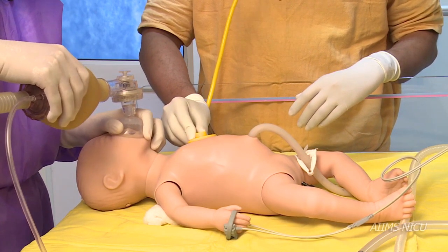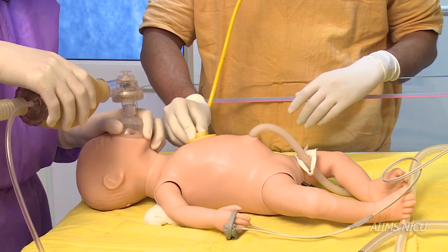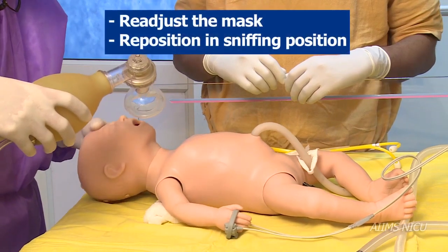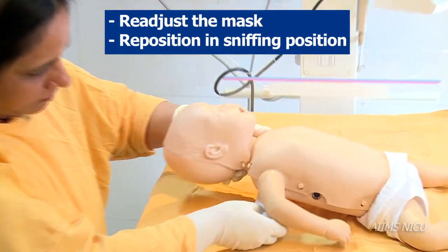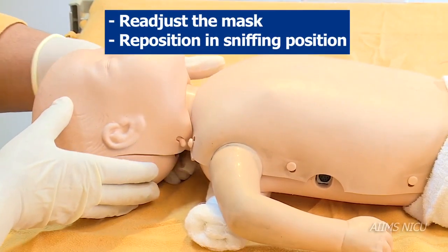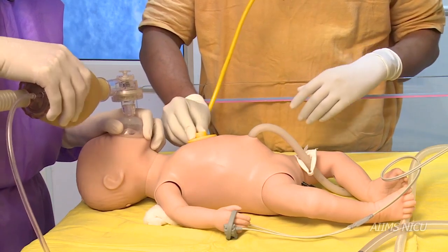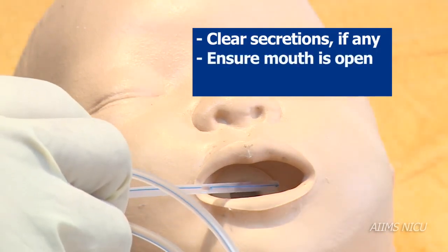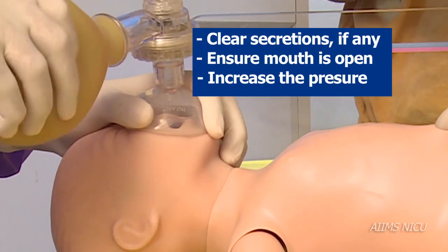After 5 to 10 inflations, if the heart rate is less than 100 per minute or chest rise is not adequate, perform the following corrective steps: readjust the mask to ensure a tight seal and reposition the baby in the sniffing position. If the heart rate is still less than 100 per minute or chest rise remains inadequate, clear any secretions, ensure that the mouth is open, and increase the pressure of the squeeze of the bag.